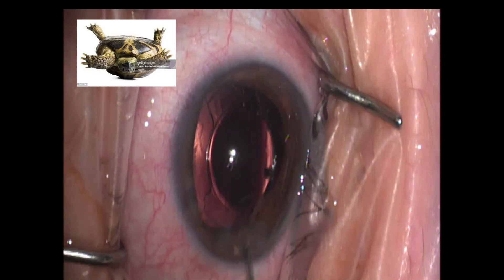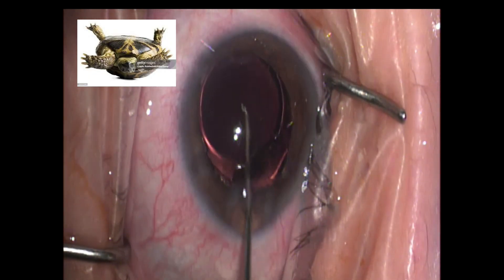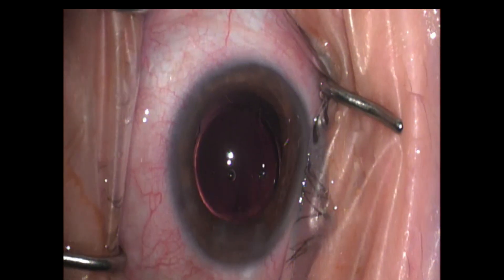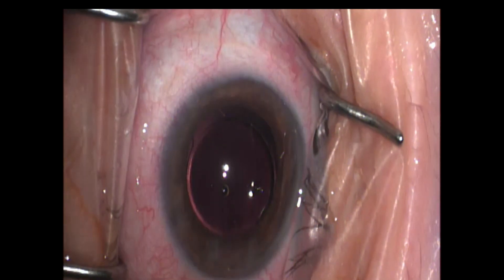This is the reason I love this lens — it's my little upside-down turtle. It's got its four little arms or legs up in the air. Those haptics keep this lens beautifully centered and make it extremely stable.